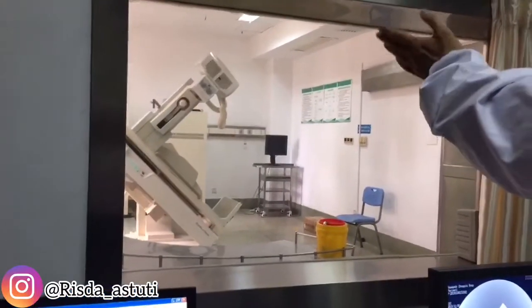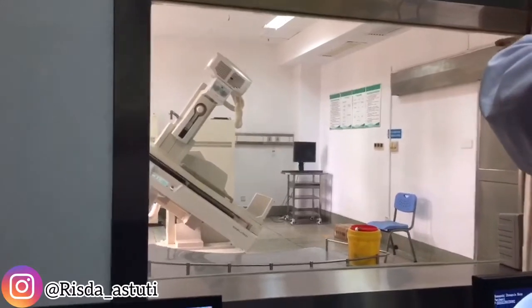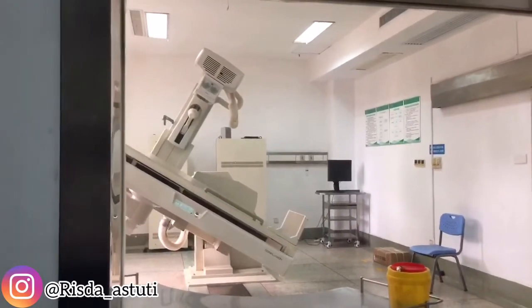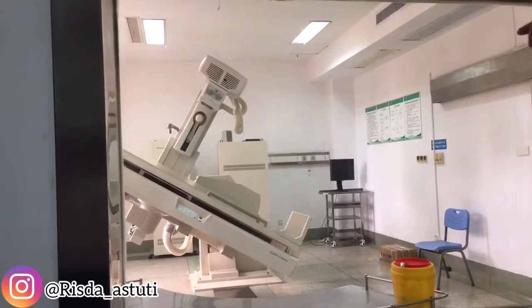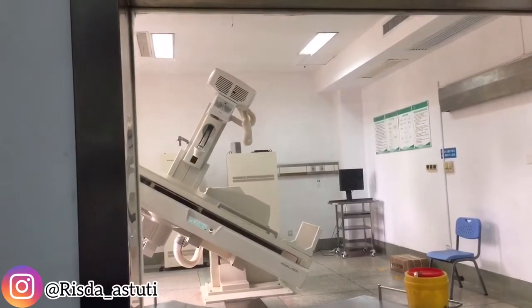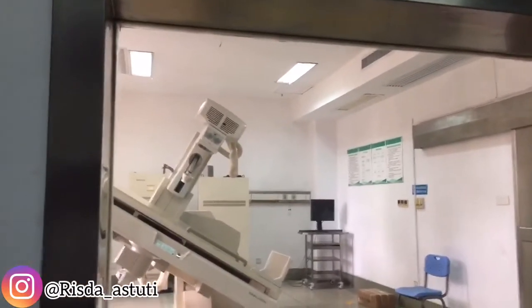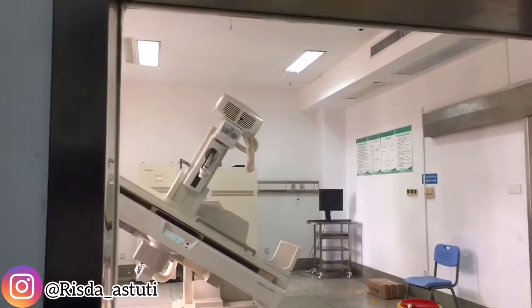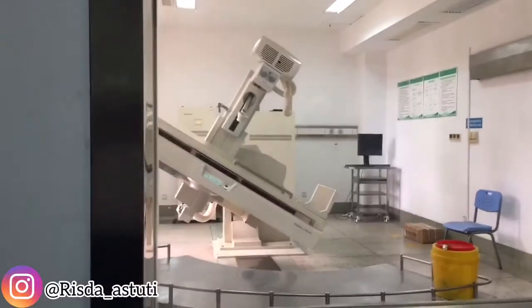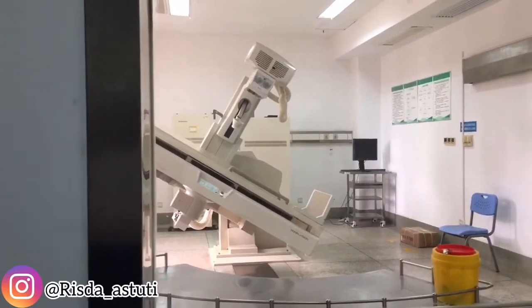I'll move the table, change the angle, or move it forward or backward, like this. What's that device? It's a compression device. Because we don't have a hand to keep pressure on the abdomen, we use that — we can call it a machine hand.